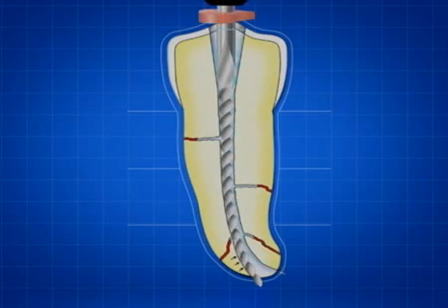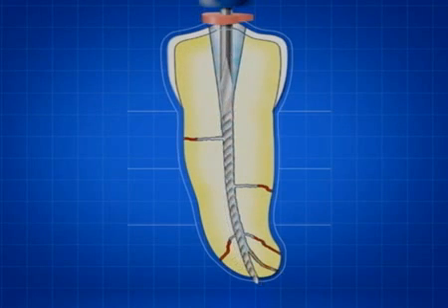A transportation results because there's been failure to pre-enlarge the canal and occurs because carrying larger, progressively stiffer instruments to length begins to relocate the foramen on the external root surface. If persistent file grinding continues in a blocked and ledged canal, a perforation may result.